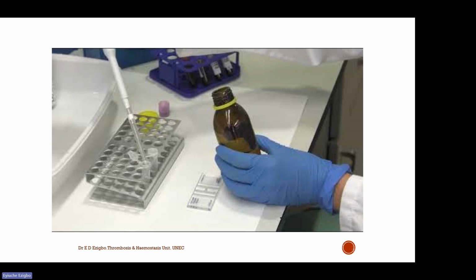So with that, in the manual procedure, this is what will be obtainable, as you can see in this video. To use the Neubauer counting chamber, you can see the blood cells, how they appear in the film.